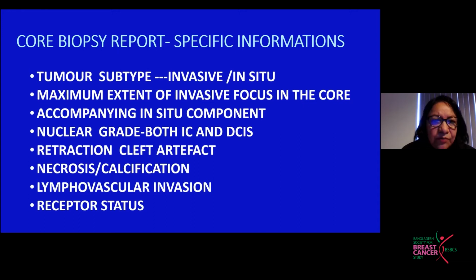And usually what in my practice I do is I do not do the total grading from the core biopsy, I just do the nuclear grading. Because these are thin strips, I'm not seeing the whole tumor. So it's better to do nuclear grading of both the invasive carcinoma and the DCIS or LCIS.